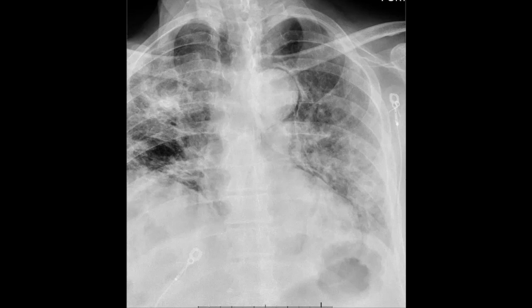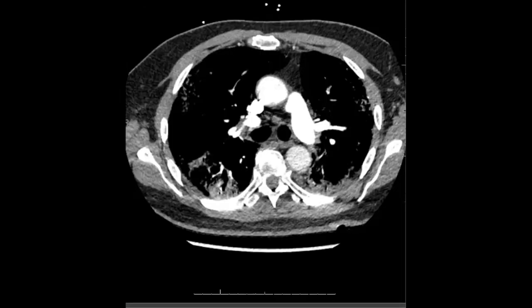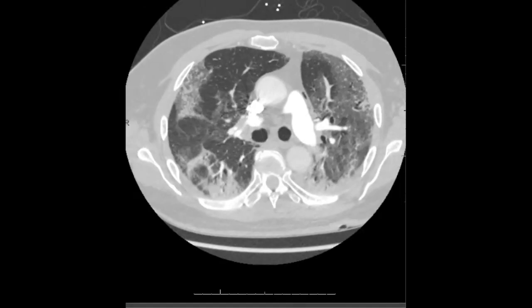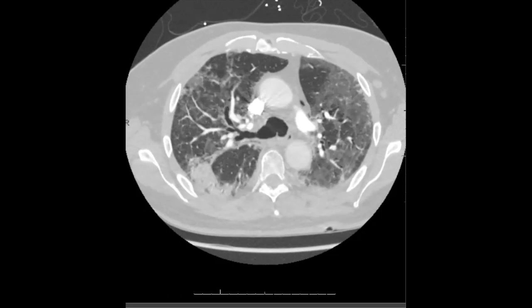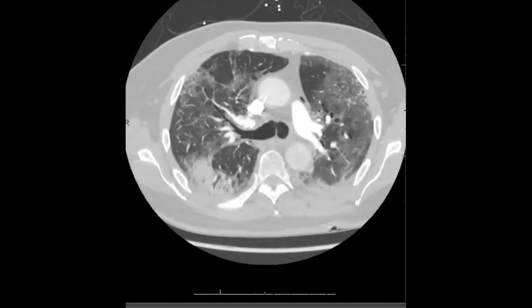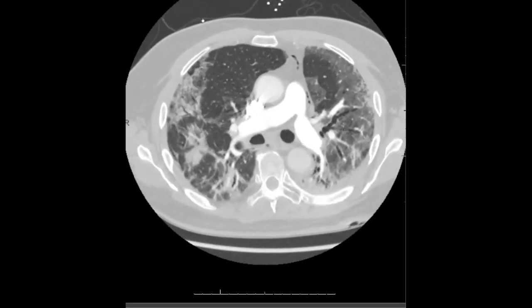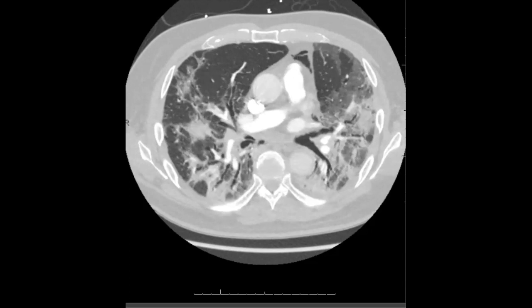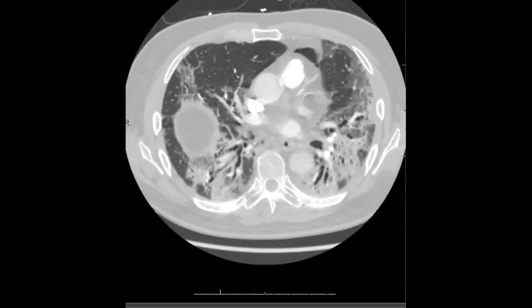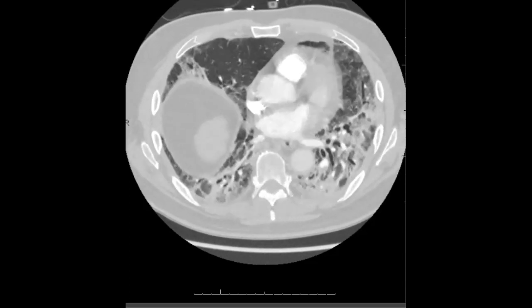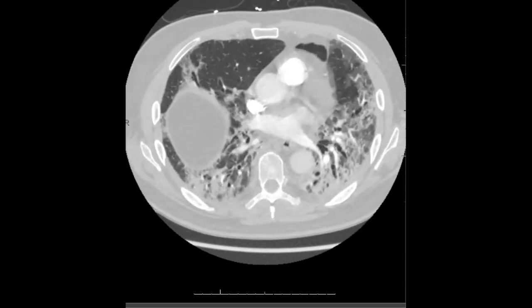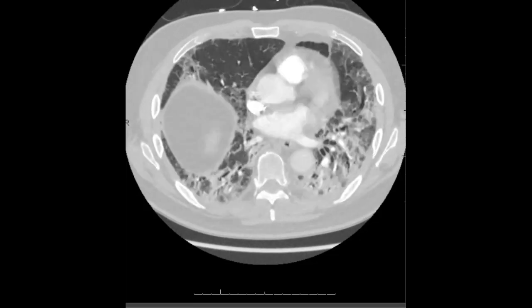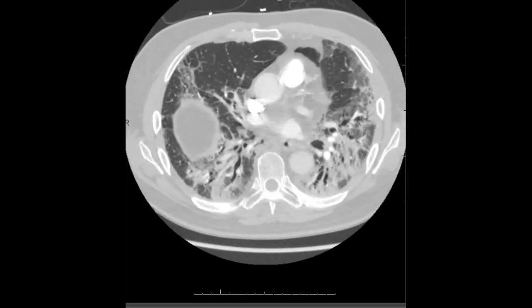The patient did have a CT, which shows indeed the patient has some pneumomediastinum here. The diffuse pulmonary opacities — ground glass opacity and consolidation — again consistent with COVID-19 pneumonia. But there is a mild degree of pneumomediastinum here.